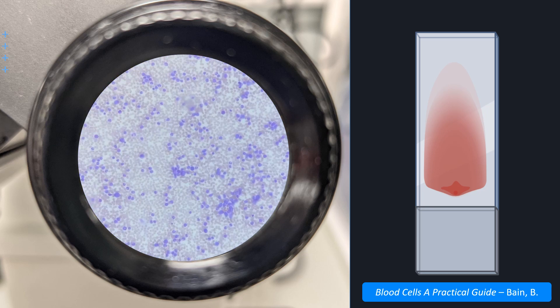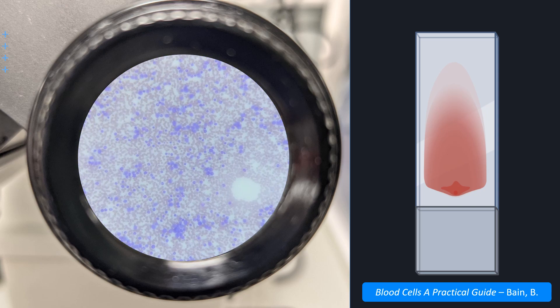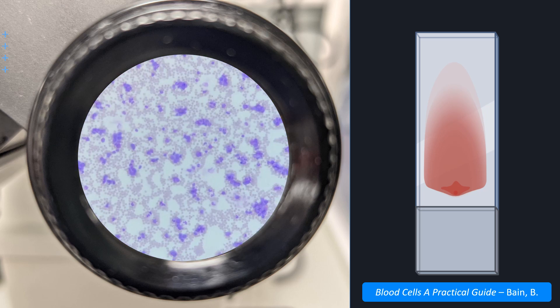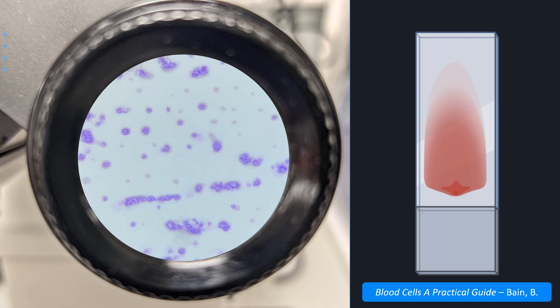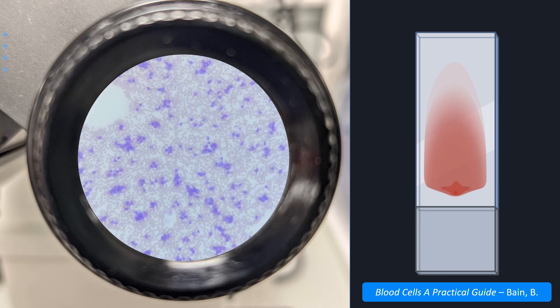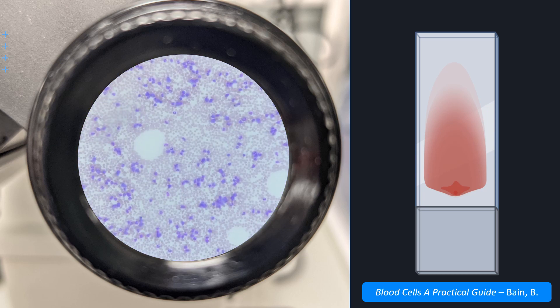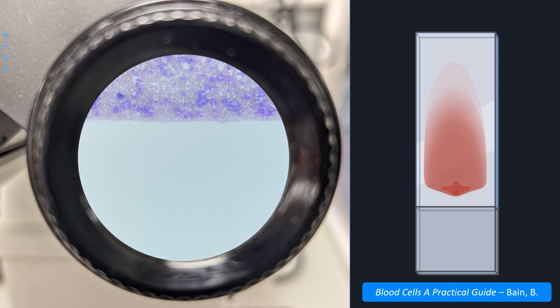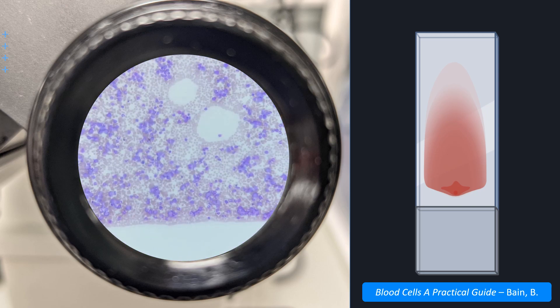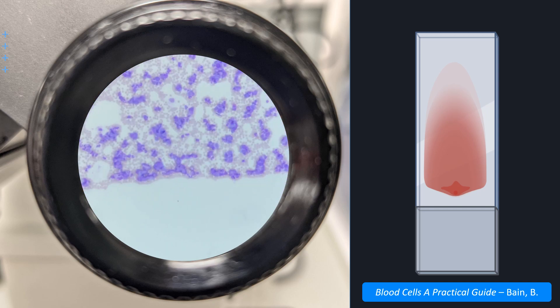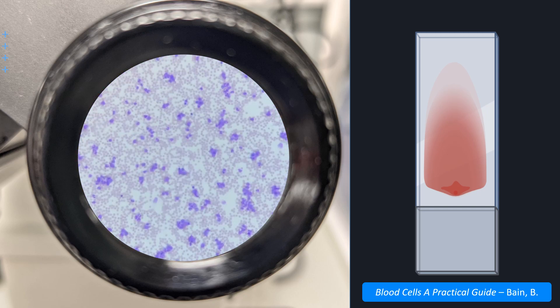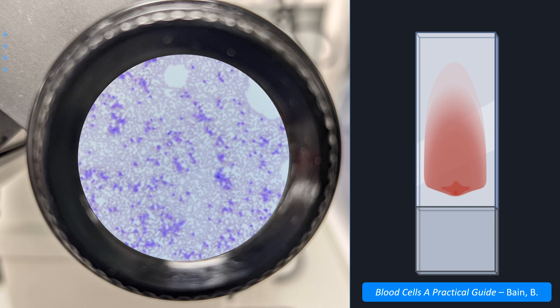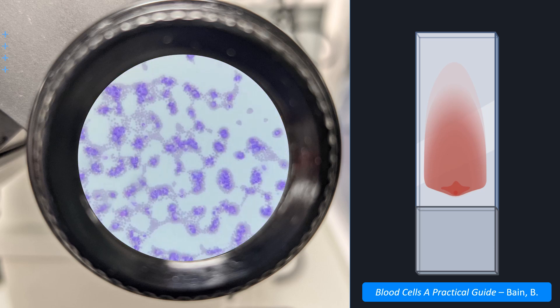White cells don't distribute evenly over the slide. In the tail, you're more likely to find neutrophils and fewer lymphocytes. Monocytes are probably the only cells that are evenly distributed. Large immature cells such as blasts, promyelocytes and myelocytes preferentially distribute to the edges rather than the centre of the film. You may even get areas where cells are clumped. This particular sample is from a patient with chronic myeloid leukemia. The total white cell count was 229, and so a standard 100 cell differential count would not give a true representation of the cells present in this case. It'll be apt to do a 300 or 400 cell count instead.